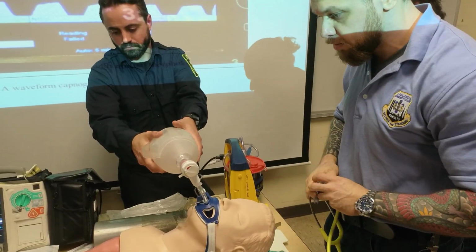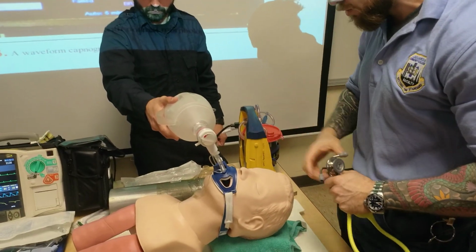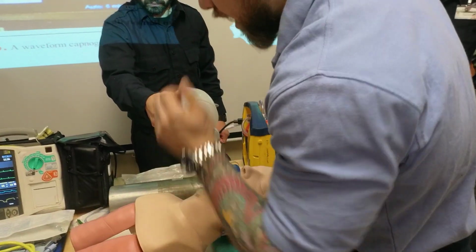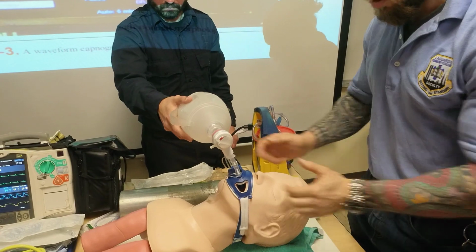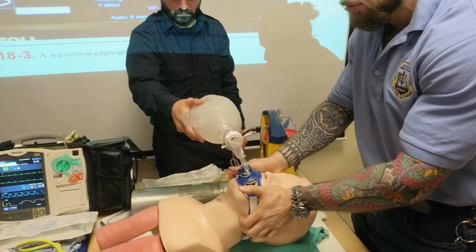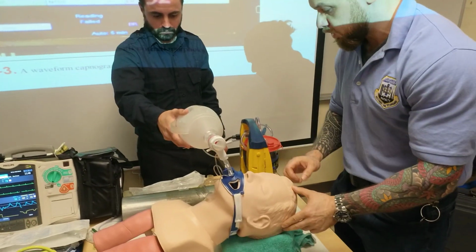I don't want to waste time in terms of the suction. They will show you how to do that, right? What I want to emphasize here is the difference between the old way and the new way that you're going to do. You're going to do the triple airway maneuver. You're going to ventilate for 2 minutes, and then we want to see that. You're going to position. You see how I position the head, right? So we want to see that.